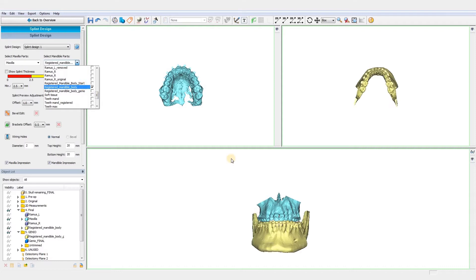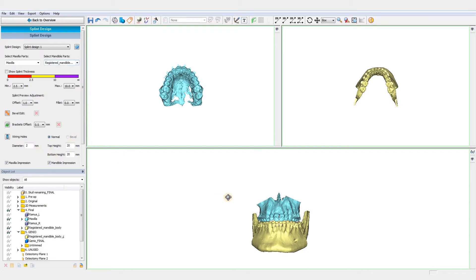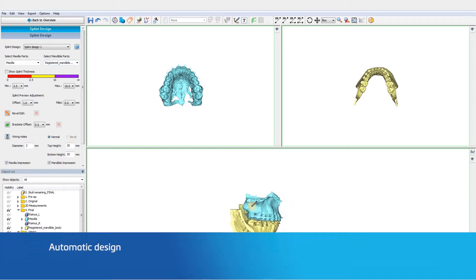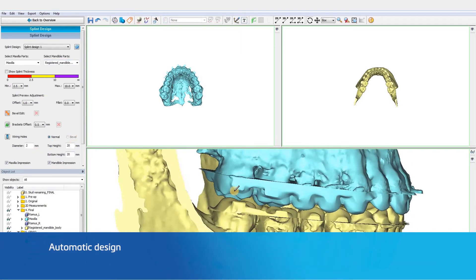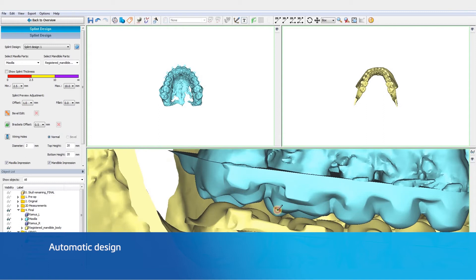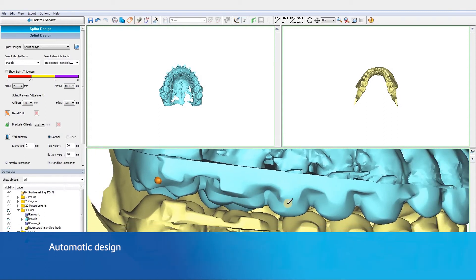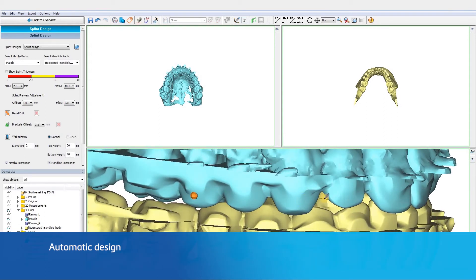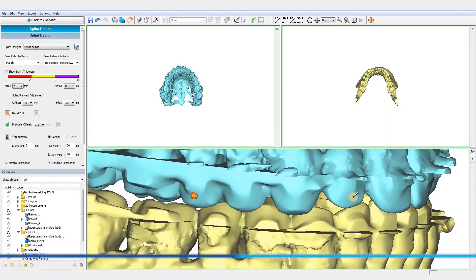In this video, we will only design a final splint, but the same process can be applied for an intermediate one. The first step is to indicate points on the teeth to outline the splint. The software will automatically calculate the splint design.